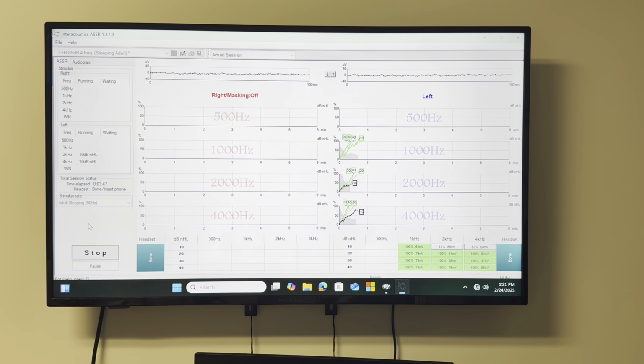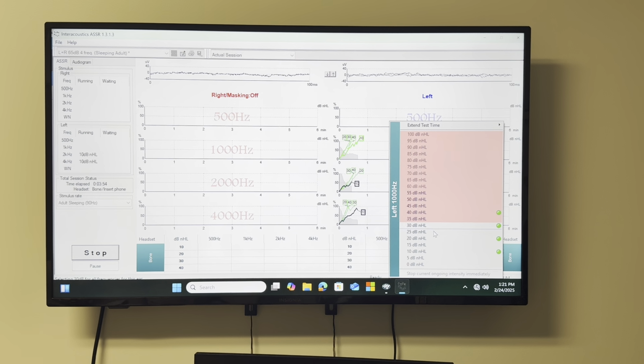I don't know how much it could be. It sounds loud, right? If you play bone conduction at 70 dB, it can go low. To which one? At 10 there is a response, right? You go down.